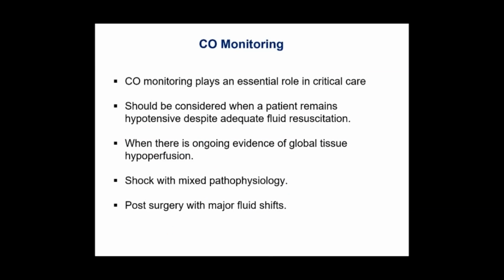Let's say, for example, we have a patient who has existing coronary artery disease. Now he develops community-acquired pneumonia, goes into a picture of sepsis, and comes in shock. Now, you do not know for sure whether the shock is because of the coronary artery problem or because of the pneumonia. So to improve our understanding and get more information, we need advanced hemodynamic monitoring, and there is a role of cardiac output monitoring in that.